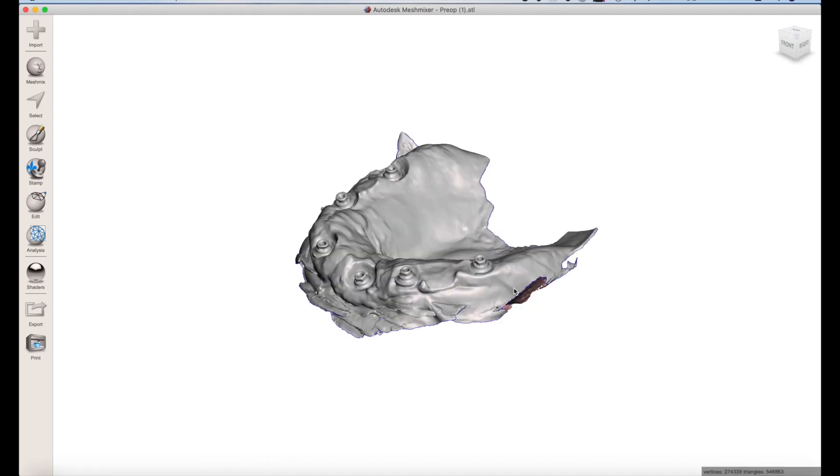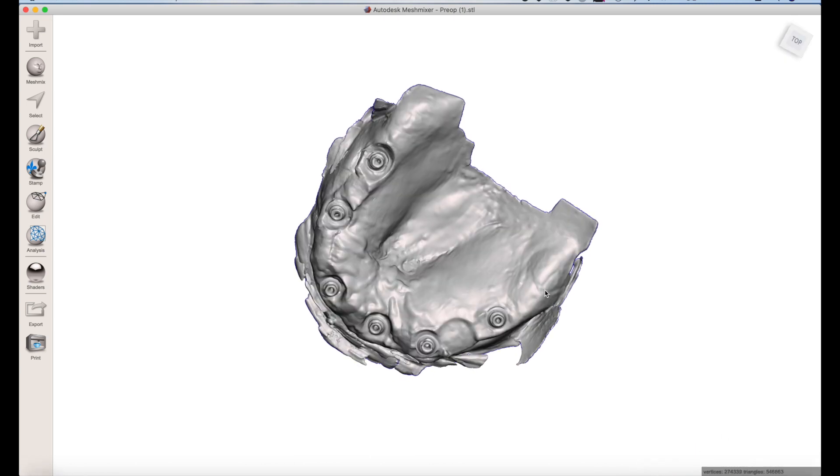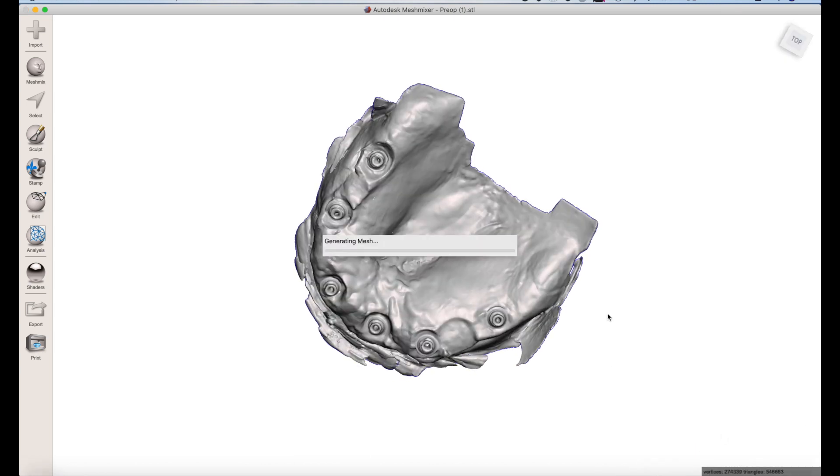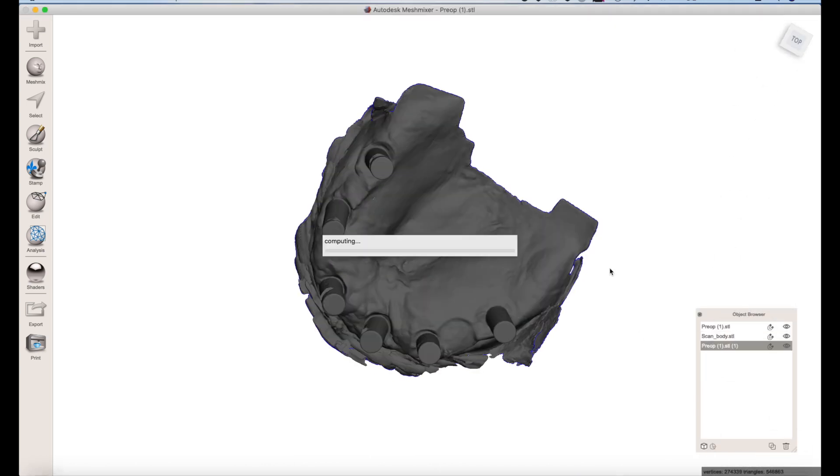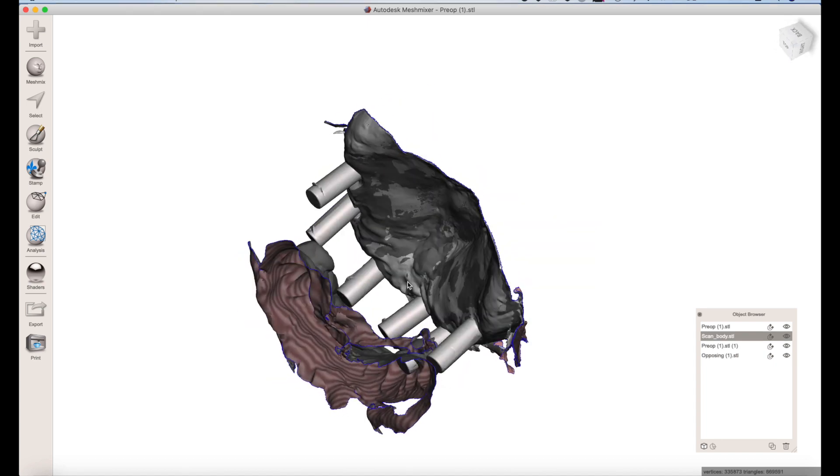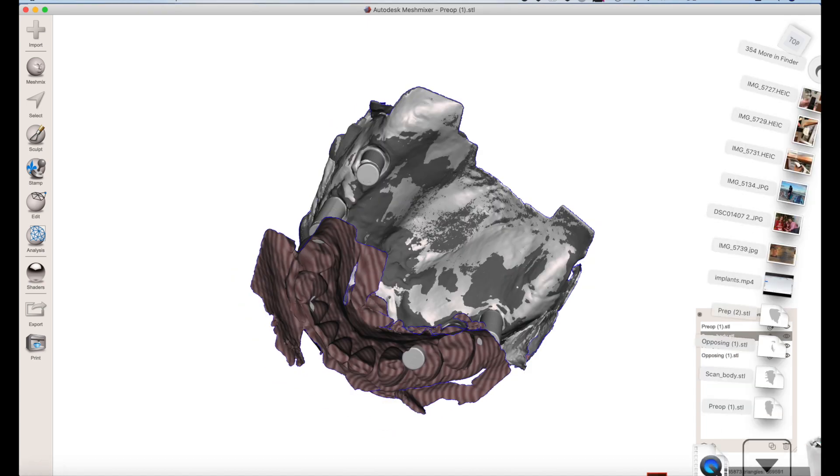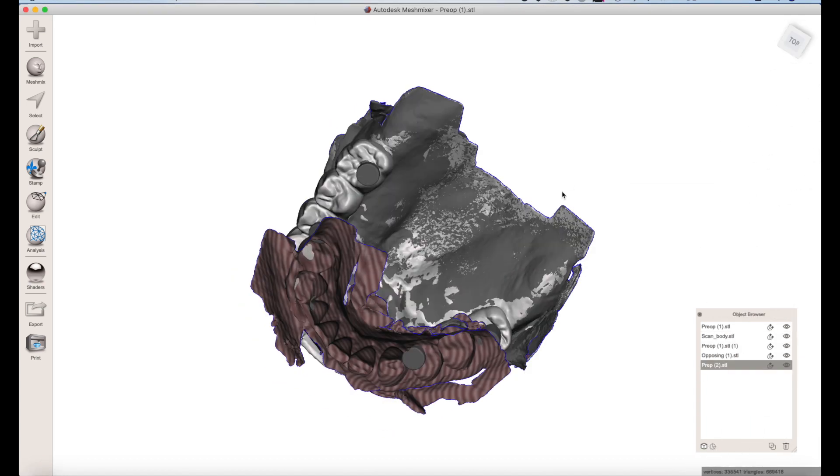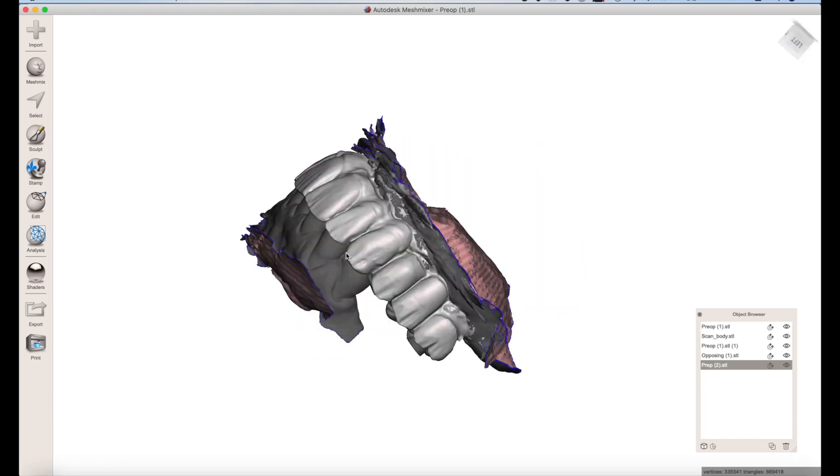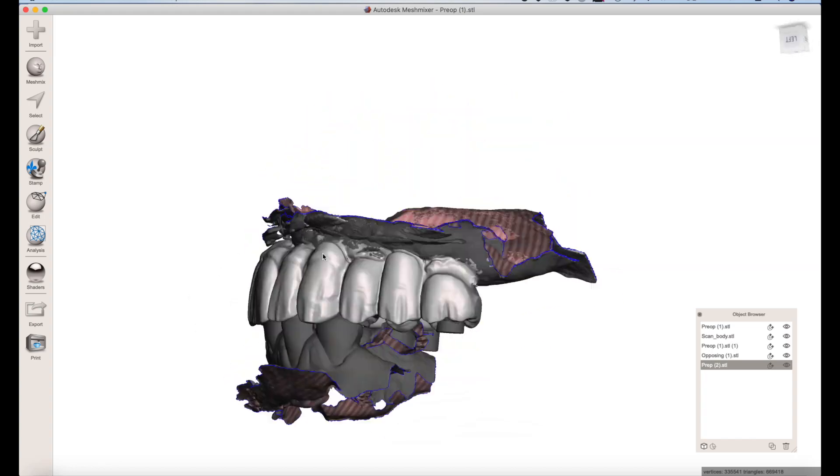So we're going to drag all these into Mesh Mixer. So there's the thing. There's the scan body. See how they're merged together. There's the bite and space. So that's all perfect. Here's the provisional. So that's all perfect. Now everything's all aligned. There you go. Have fun.